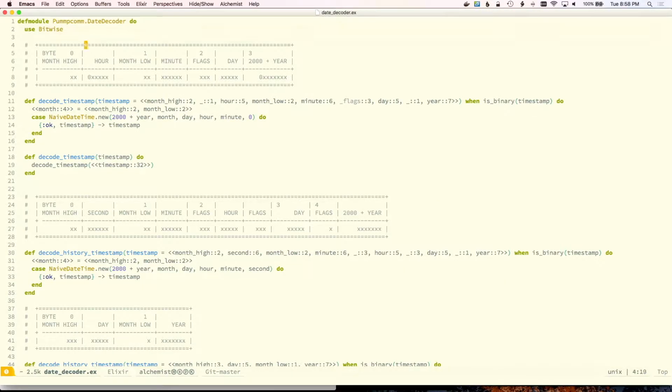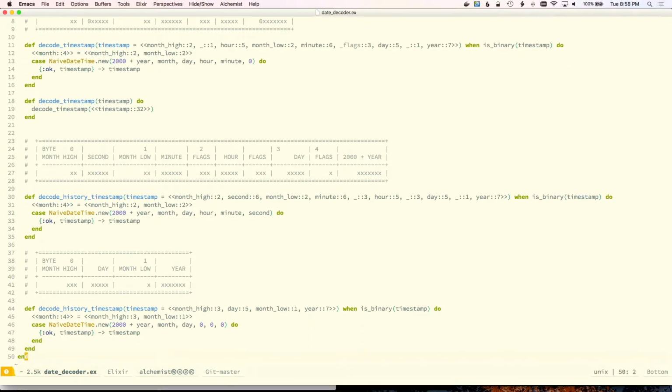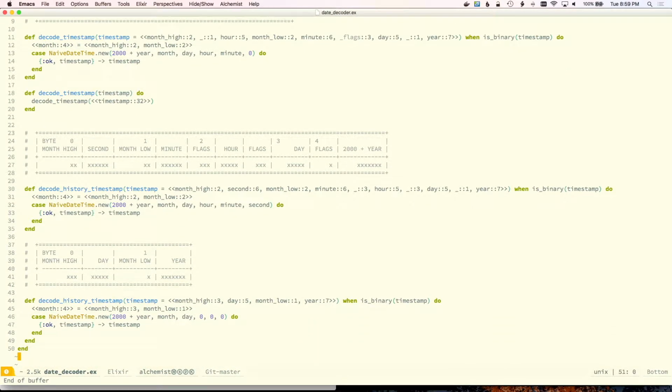I tried to be pretty proactive on my documentation of this thing, since those bits are really strange. Some of these flag columns or bits are used for various completely unrelated things. Like if a command happens to have a timestamp, but also some other things involved with it, sometimes they'll just throw stuff into these flags related to the command and not at all to the date. I'm imagining that's probably run-of-the-mill when you're trying to pack everything in really tight, but it's weird that they happen in the middle of these bytes instead of at the end or somewhere else.